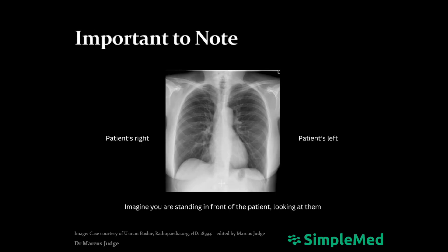At this point, it is important to highlight that a chest X-ray is flipped when viewed. The patient's right will be on the left of the chest X-ray as you view it. This is why the patient's heart can be seen on the right of the image, despite being on the left-hand side of the body. You will become used to this as you see more X-rays, but it's worth being aware of when learning the initial anatomy and when describing your findings.